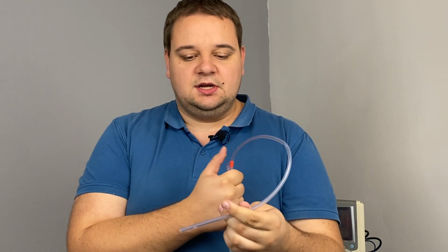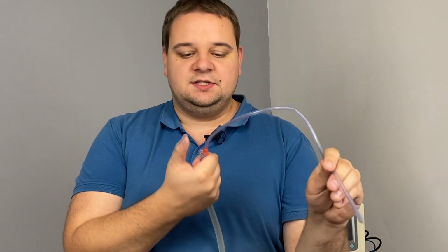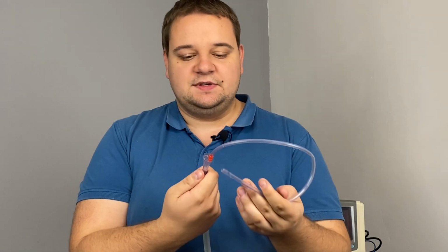So in this case, we don't stick to anything. We do not suck the patient tissues up, and we can get it as deep as possible. We can navigate the device, and we can always just manually control when we want it to pump. That's a good thing for control. Not every catheter has something like this.